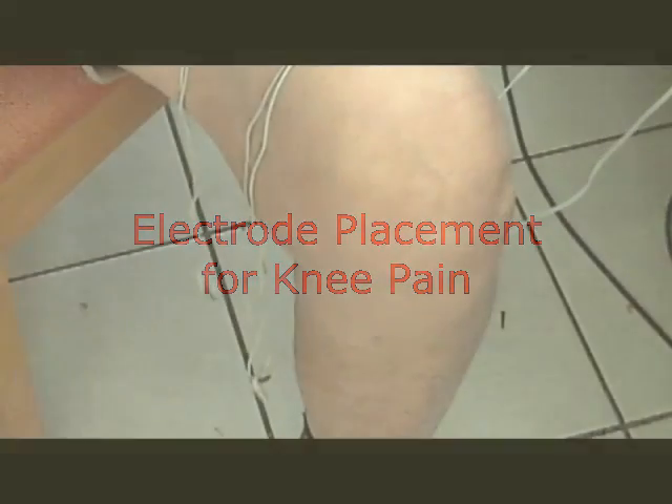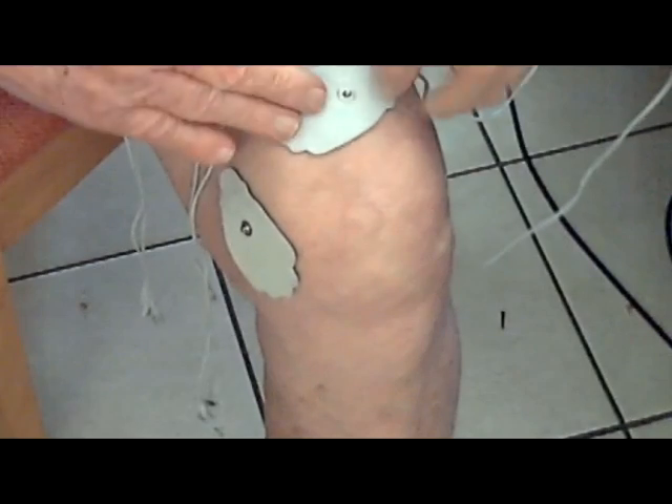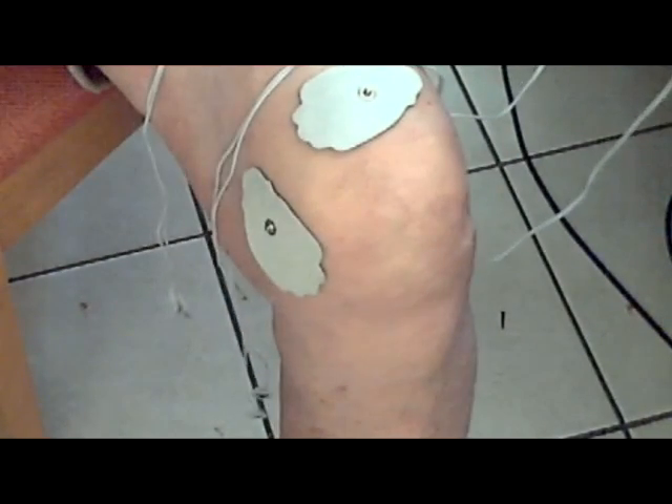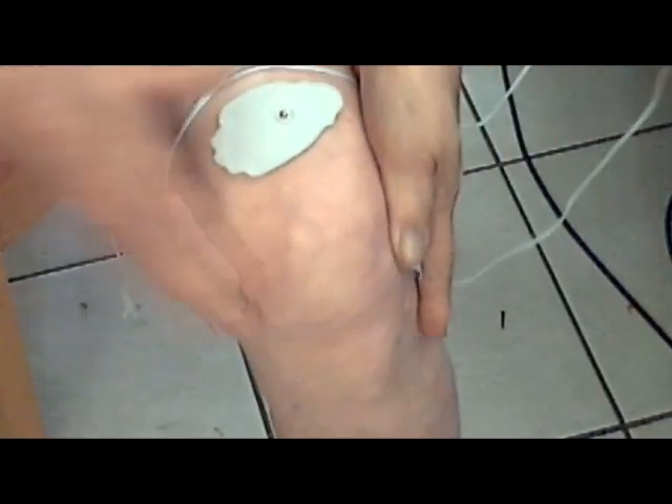Here I'd like to show you the best placement for your electrodes to help relieve knee pain, either from arthritis or injury. Locate a spot on the inside of the knee where the two bones meet and place one electrode there. Find the same place on the outside of the knee for the other electrode.